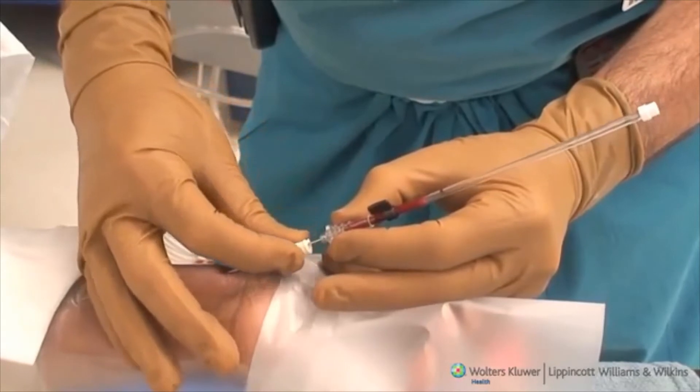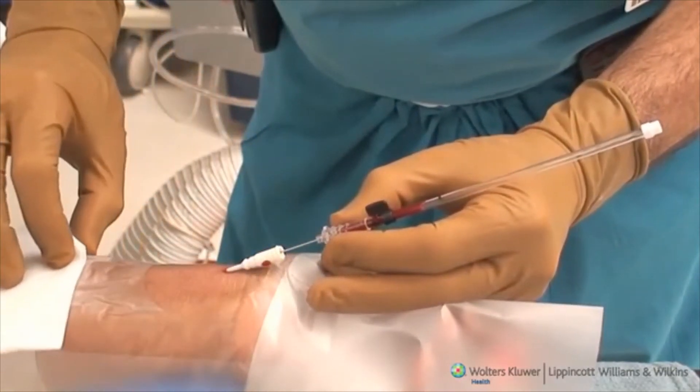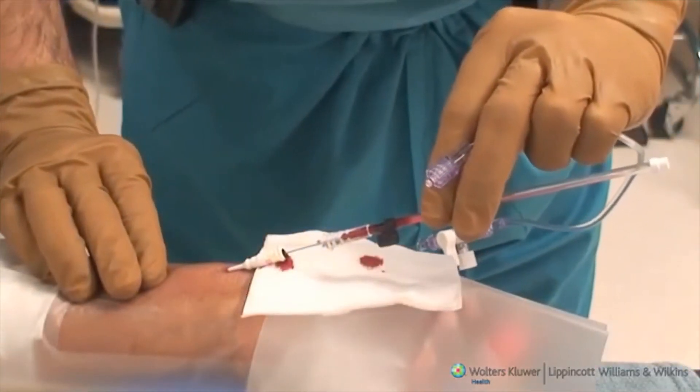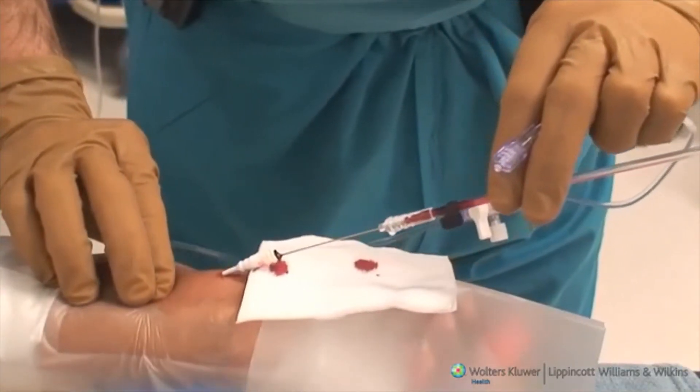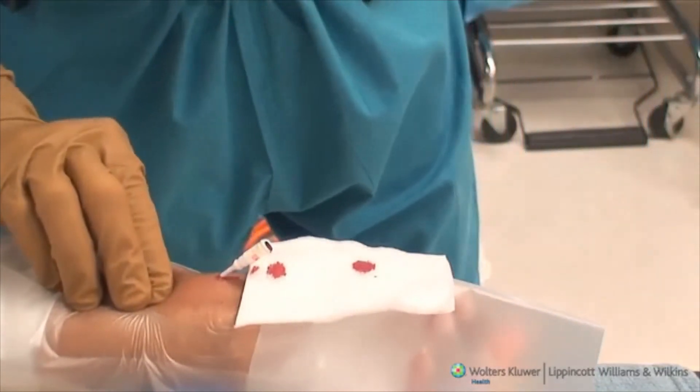Once the guide wire has been introduced into the artery, the introducer needle is held in place and the catheter is advanced forward over the guide wire and into the vessel. Pressure is applied proximal to the catheter to minimize the spillage of arterial blood, and the needle, guide wire, and feeding tube assembly are removed.